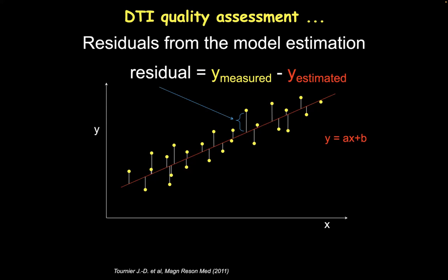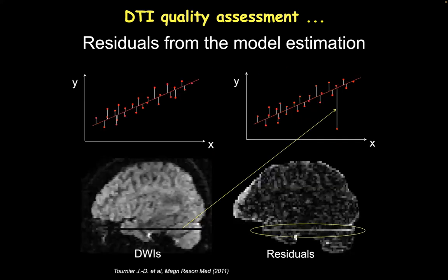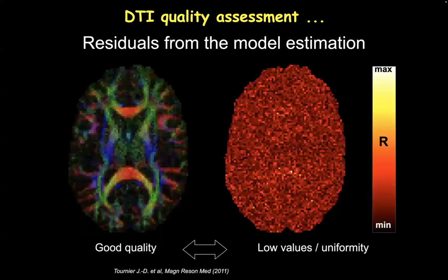This is a residual. When we do this with images, and I think this is a message for fMRI as well, or any technique, visualize these residuals. Suddenly where you had artifacts, or maybe something you missed in your QC, or you have a big outlier, this lights up in the residual maps. So in TractoFlow, we always output the residual and we show it to you in an HTML report. That's the holy grail of residual. It never happens: a perfectly flat image with no structure. There's always a bit of structure.